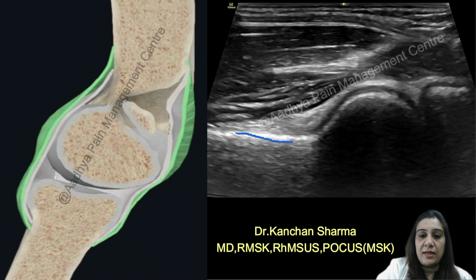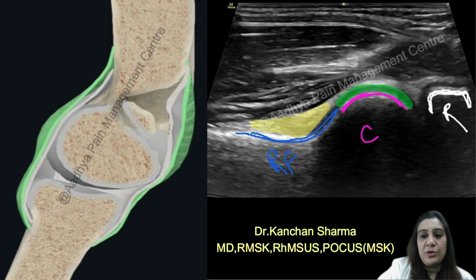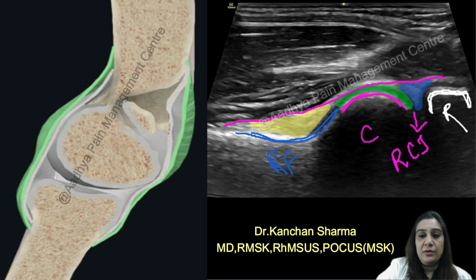So now this concave shaped depression is the radial fossa, which is harboring the fat pads. This is the capitulum with the hyaline cartilage over it. This square shaped structure is the radial head, and what you are seeing here is the synovial fringe, and this is the capsule of the elbow joint, and what you are seeing here is the radiocapitular joint.